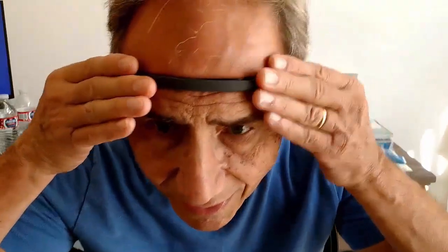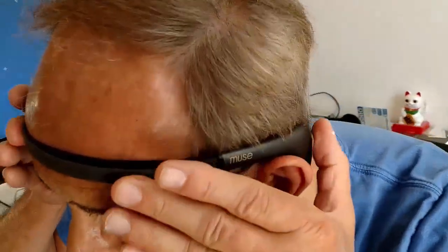The other thing is I usually take my glasses off to put this on, although you could use it with your glasses on. I take my glasses off first, and then you push these back like that and snap it into position. Now, you'll notice it's still a little loose back there. It's a little loose right here as well.